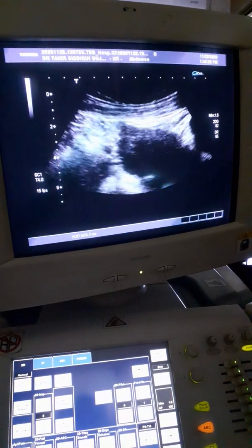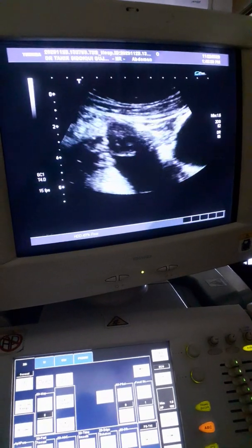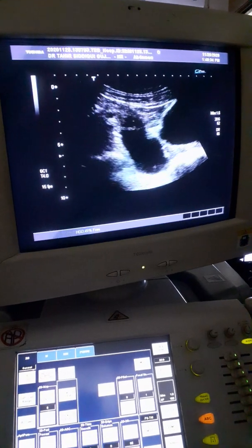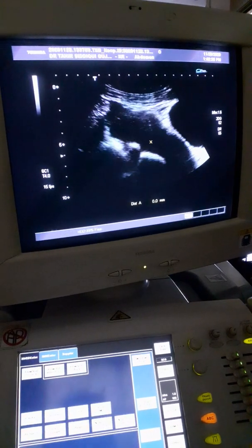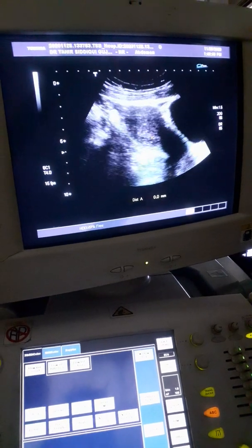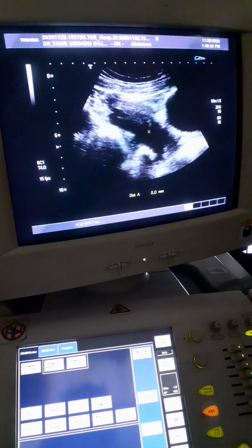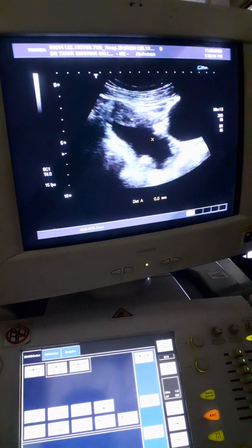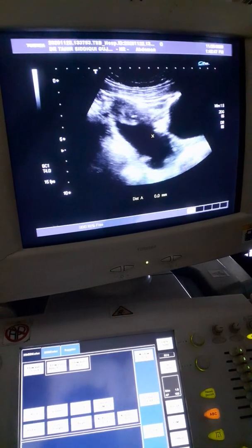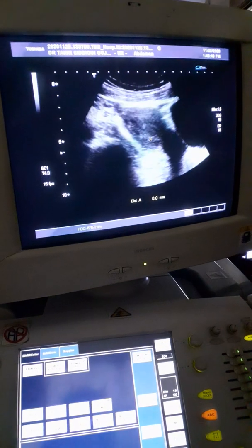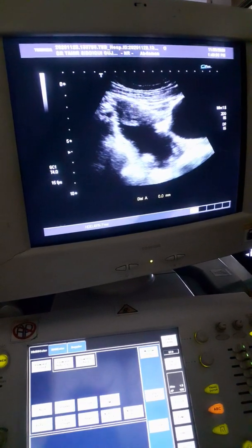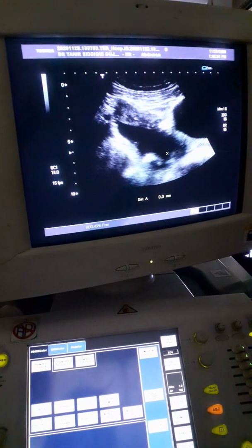This appears like a cyst, but this is a fluid collection. The uterus in longitudinal section — as I move the probe towards the inguinal region, the right ovary region, I see fluid posterior to the uterus. This is the ring, this is the fluid.